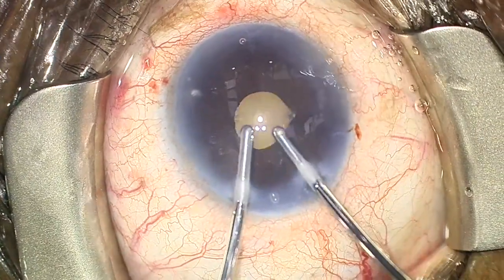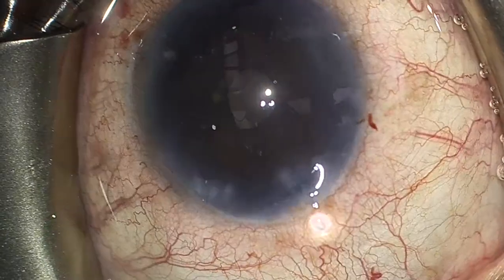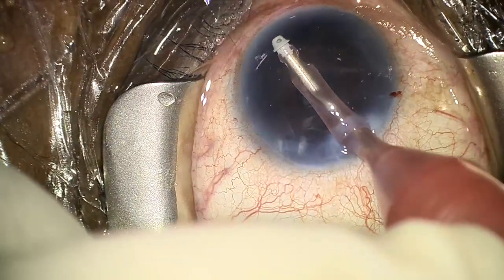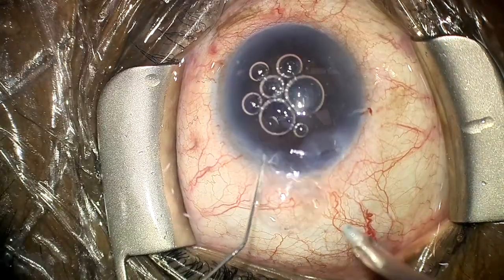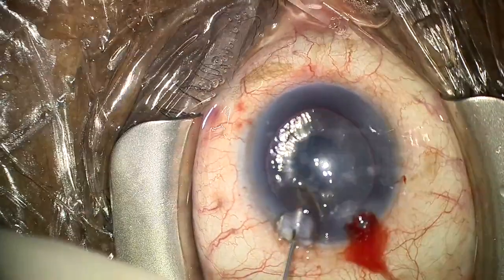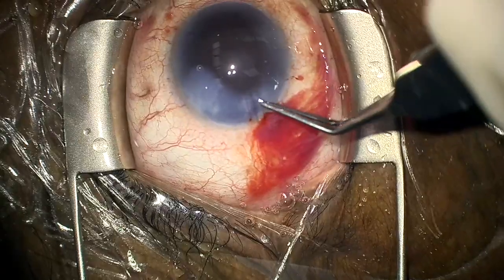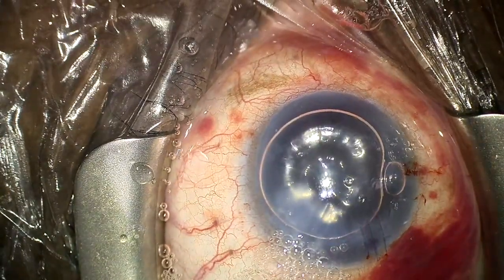Bimanual IA was used to remove the Healon 5 and pull out the helon that was trapped at the interface. This bimanual IA handpiece is a relatively smaller gauge and was not as effective at removing Healon 5, so a large main wound was made so that coaxial IA could be used to further remove Healon 5. The IA tip was swept back and forth under the area of the Descemet's detachment to make sure all the helon at the interface could be pulled out. Descemet's appeared to be back in place, and in order to help it stick, an air bubble was injected into the AC with the intention to leave it for 5 minutes. Despite hydrating all the wounds, the air kept escaping out of the large 2.4 millimeter main wound, so we refilled the chamber with helon, sutured the wounds, then rinsed the helon out of the AC again and re-injected a large air bubble.